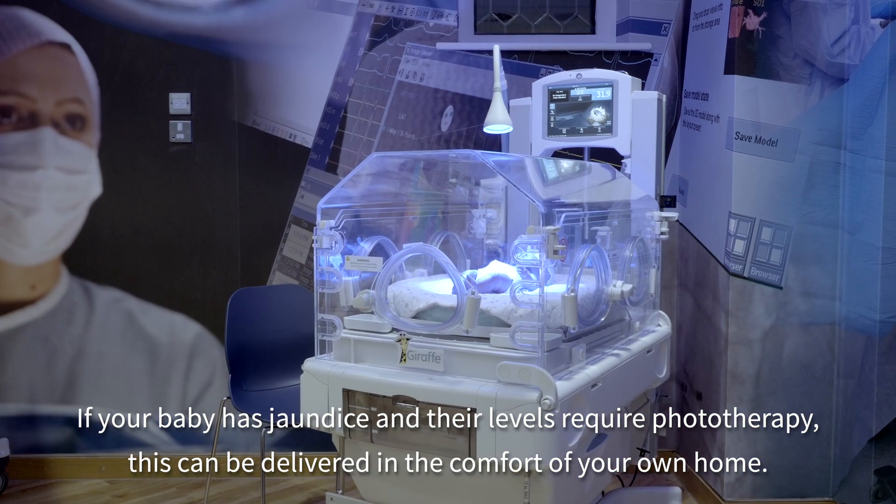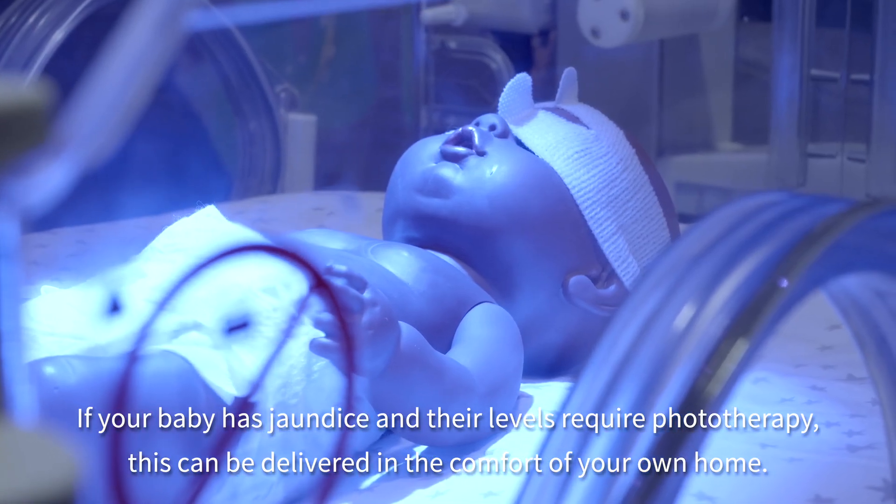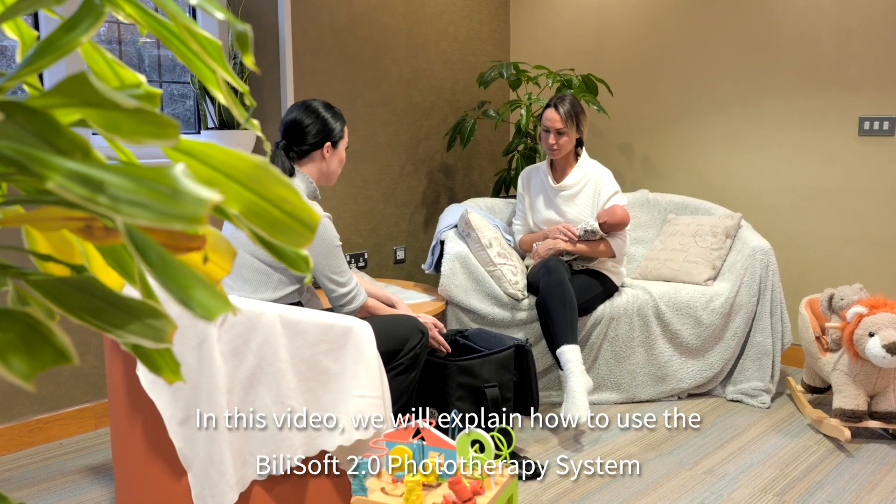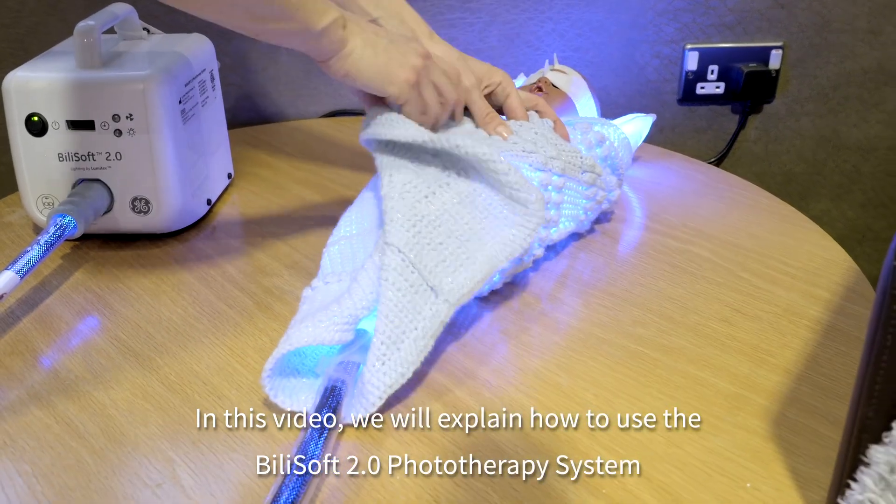If your baby has jaundice and their levels require phototherapy, this can be delivered in the comfort of your own home. In this video we will explain how to use the Bilisoft phototherapy system.